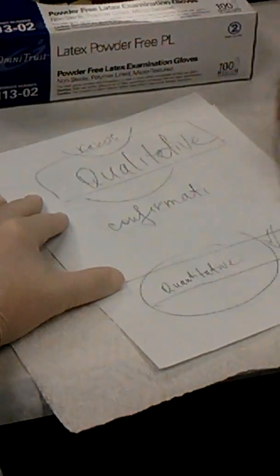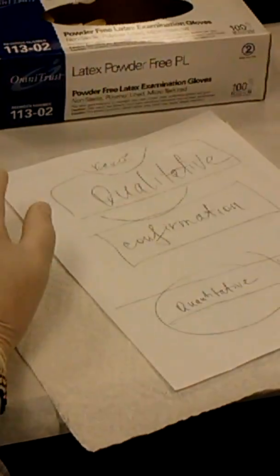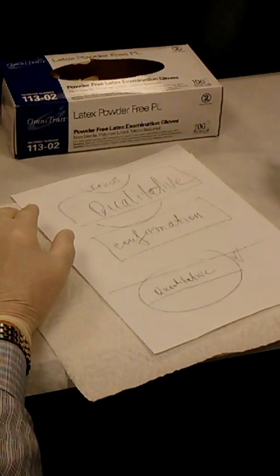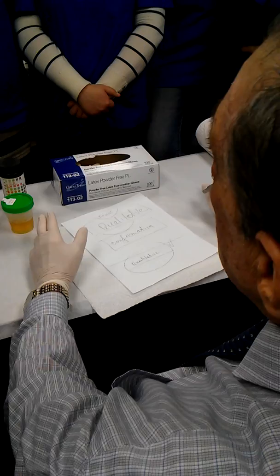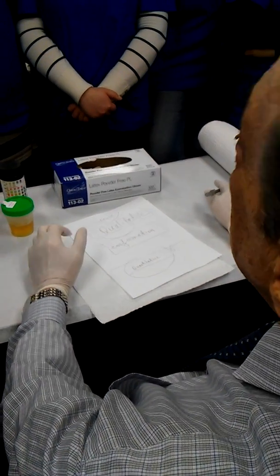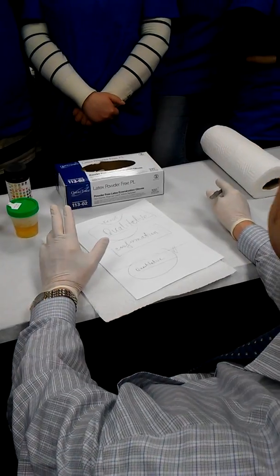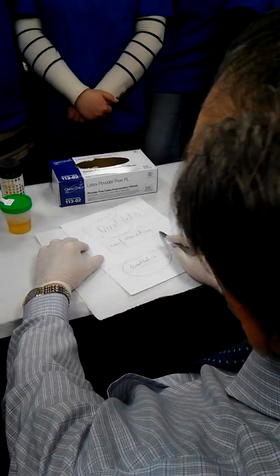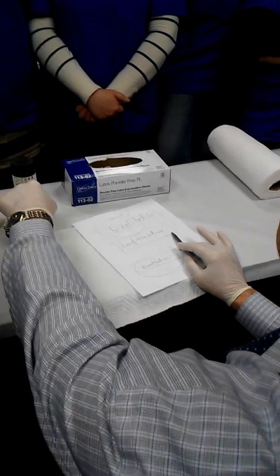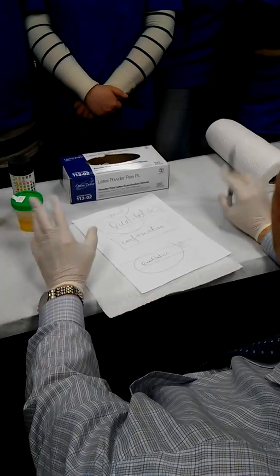This page will be on the table. Okay, what does confirmation mean? If you found something in the urine that is not good, protein, sugar, or something else, it means the test is positive. Positive is not good. It means that you found something in the urine. If you found something, you have to send the urine to the lab for confirmation. So is it clear? Good.